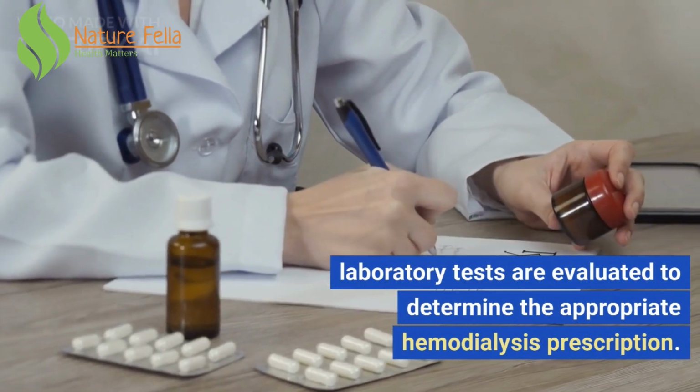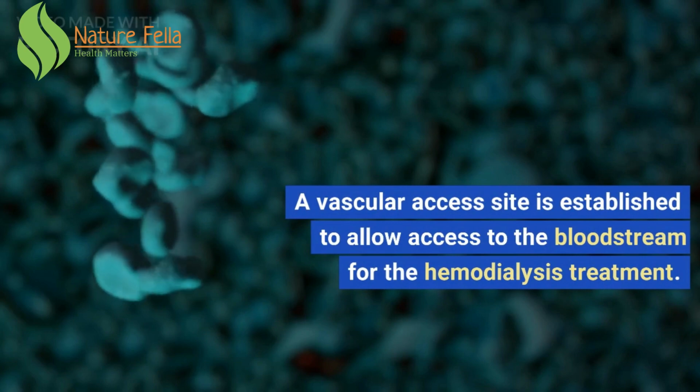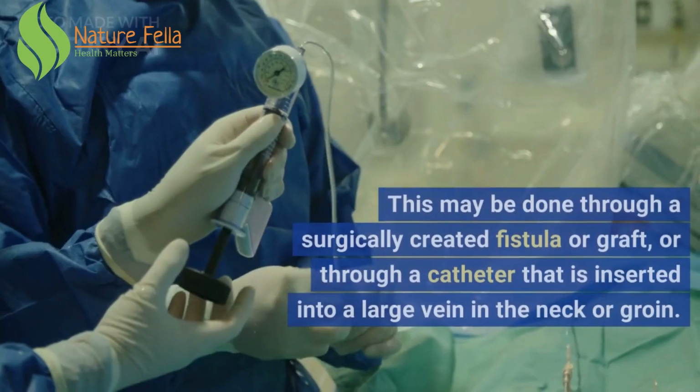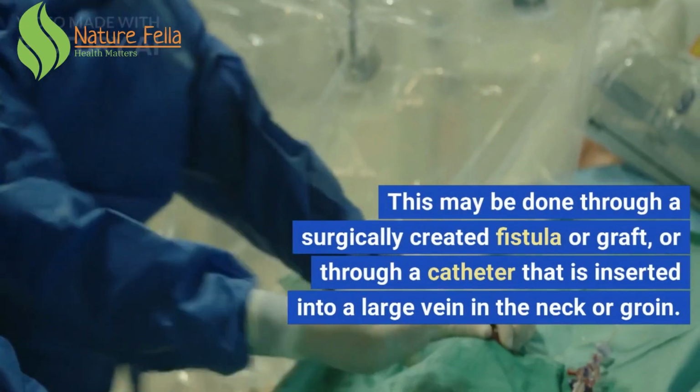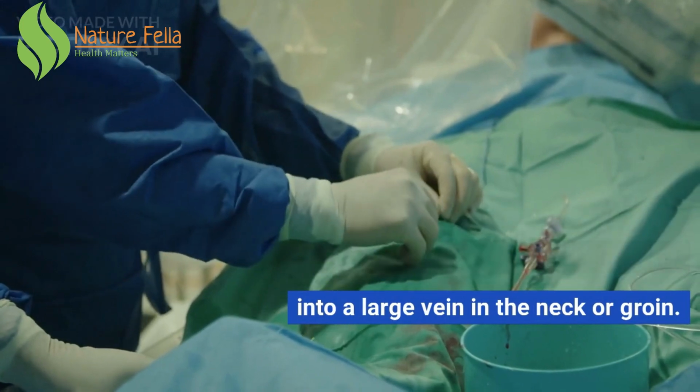Preparation for hemodialysis. Before the procedure, the patient's medical history, medication use, and laboratory tests are evaluated to determine the appropriate hemodialysis prescription. A vascular access site is established to allow access to the bloodstream for the hemodialysis treatment. This may be done through a surgically created fistula or graft, or through a catheter that is inserted into a large vein in the neck or groin.